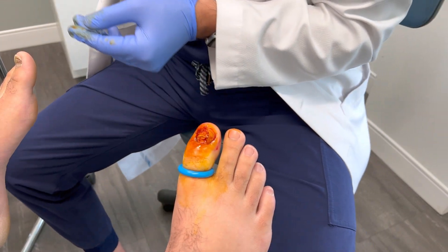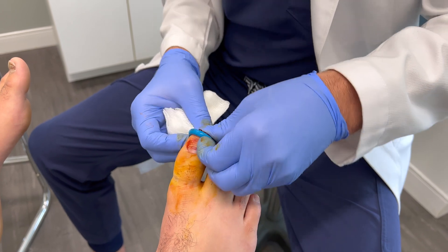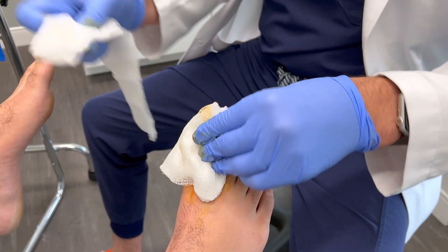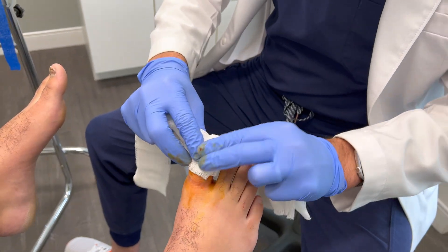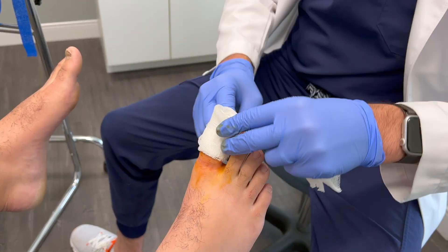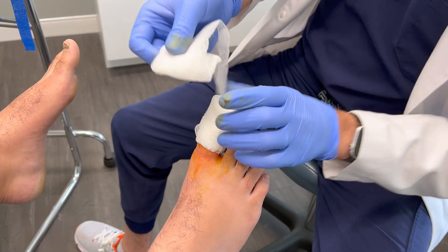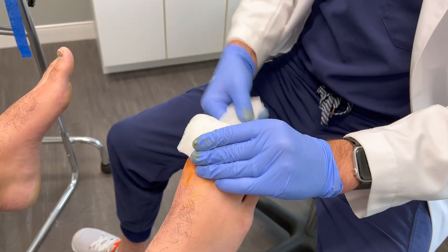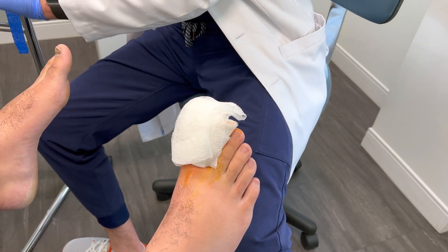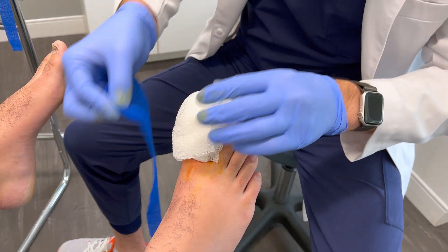We'll apply a dressing in just a second here. Patients generally do quite well post-operatively. Strong pain medications are rarely necessary after a procedure like this, and it is exceedingly rare to see an infection because of the procedure — therefore prophylactic antibiotics are not recommended. I'll usually do a post-op check approximately two weeks post-op, and it can take a good three to four weeks for the toe to completely calm down from the procedure itself.